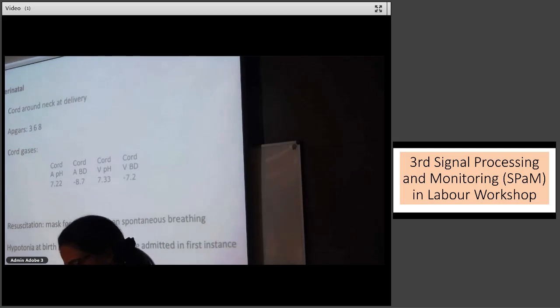So I think what Barry is saying, I agree with up to a point. If the duration of those contractions have been such that there was little time for the baby to recover before the next contraction, then they'll end up with time periods judged to be at least 1 hour where there are repetitive episodes of hypotension. That's actually what seemed to correlate with the pattern of injury that we're seeing.